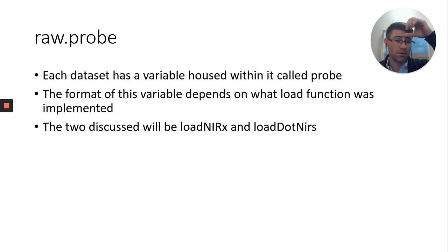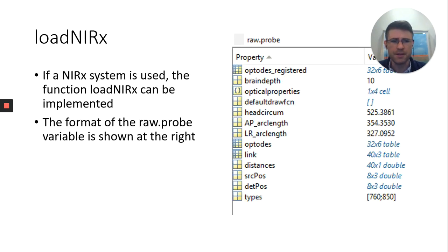So this probe variable is different depending on what load function you use. If you're using a NIRx system, you typically have two options on how to load your data in. This can be either the loadNIRx function or the loadDotNirs function. These are actually a little different depending on which you load in, and this is strictly because with NIRx data, you automatically have an atlas and atlas information. So when plotting on a three-dimensional atlas, it's already registered there.